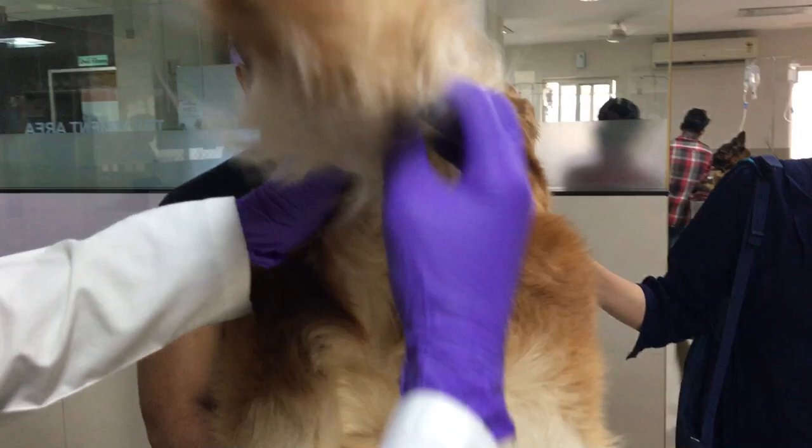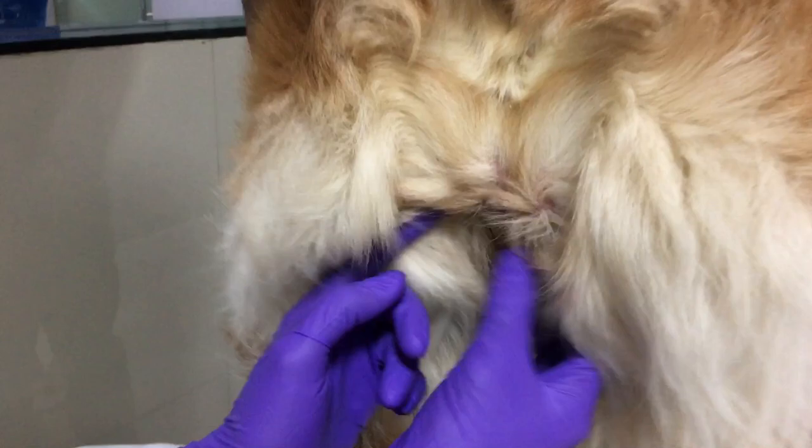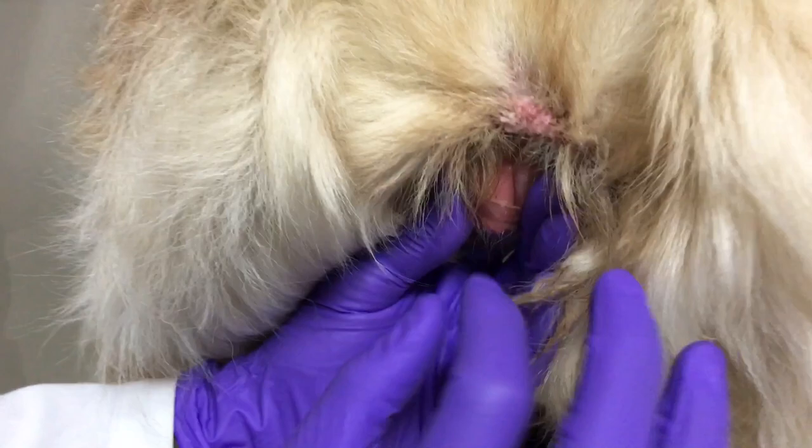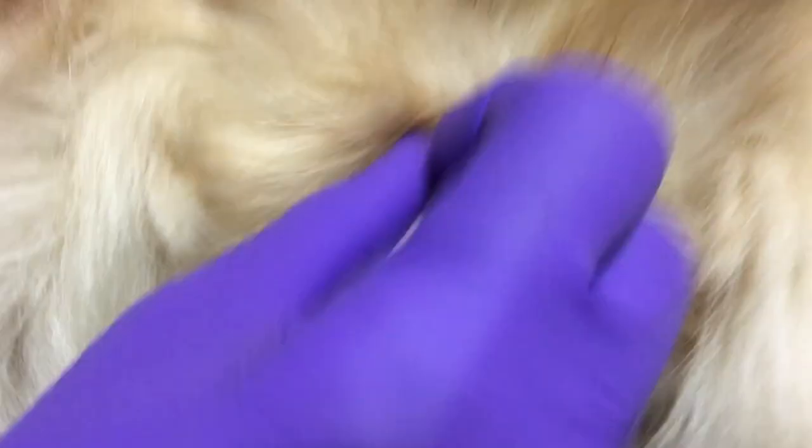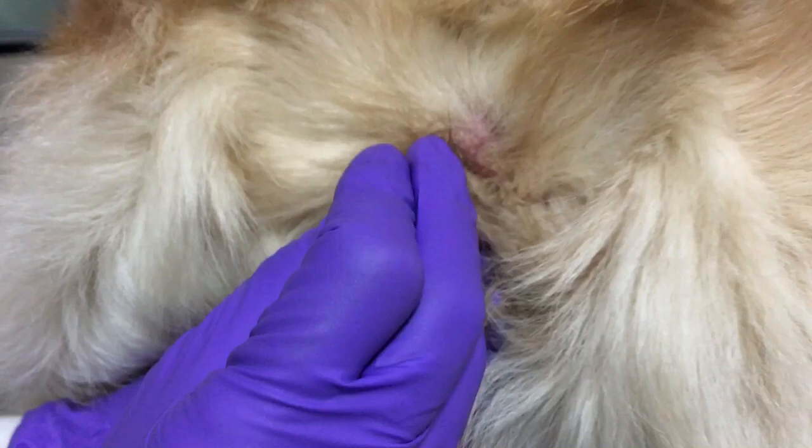Make someone hold the tail upright. With my non-dominant hand, I am going to expand the vulval opening with my thumb and middle finger and place the index finger behind the vulva. Now I am going to insert the swab that is dipped in normal saline. You need to proceed with the swab at 90 degrees, and as soon as you touch the vaginal floor it should be at 180 degrees.